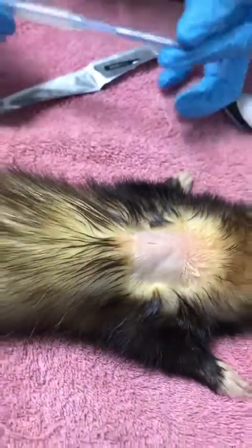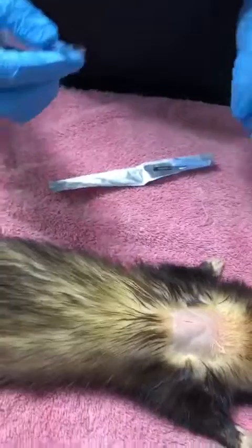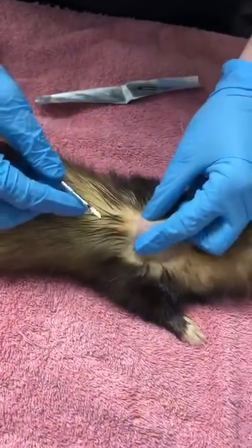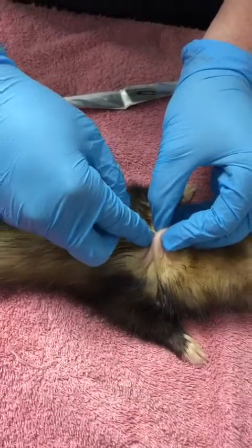This is the needle — it is humongous. So we do ours under a very quick general anesthetic. We've got our hole; we want to lift that up and put our needle into that hole.